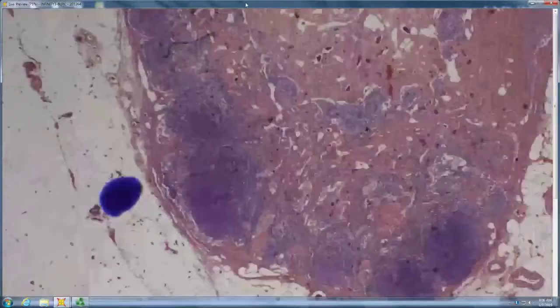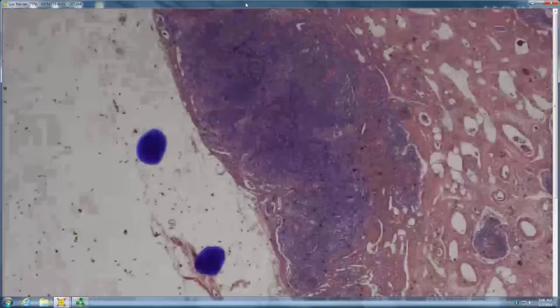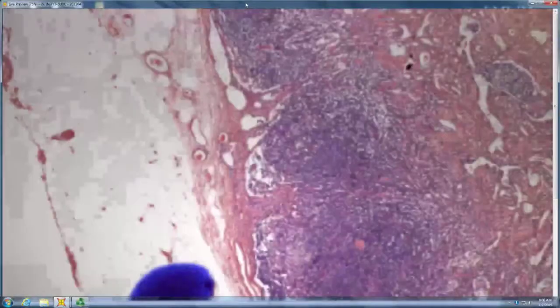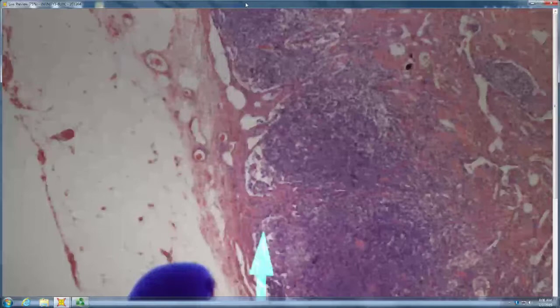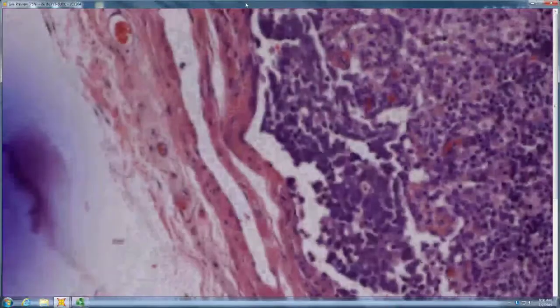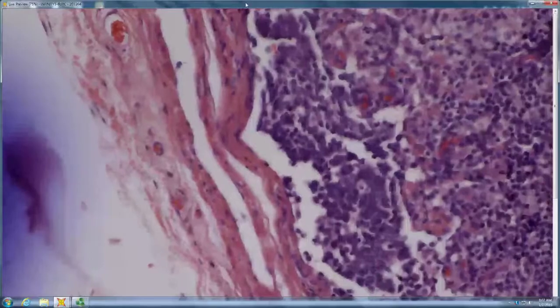Okay, this is what? Lymph node. And then subcapsular spaces within lymphatics is always where you're going to look for metastasis. Okay. And in this case, the metastasis is something that's small blue smudgy cells. This is sentinel node positive Merkel.